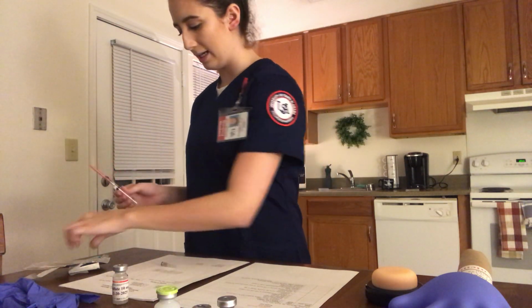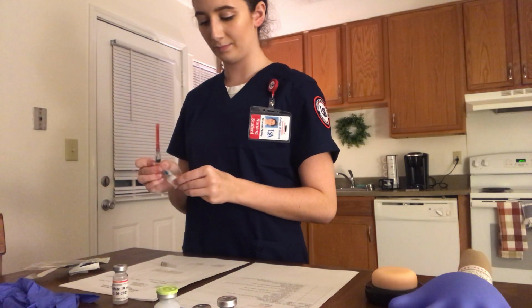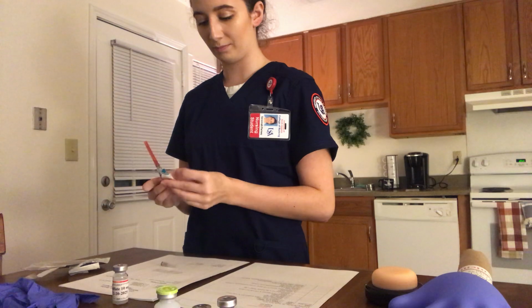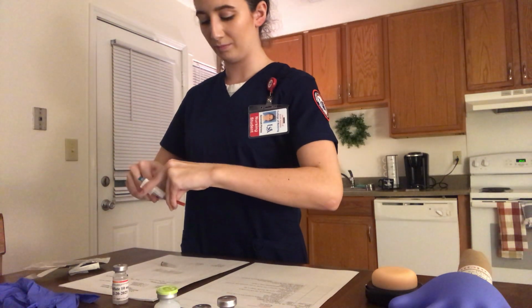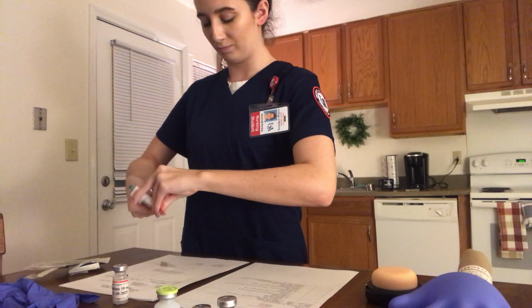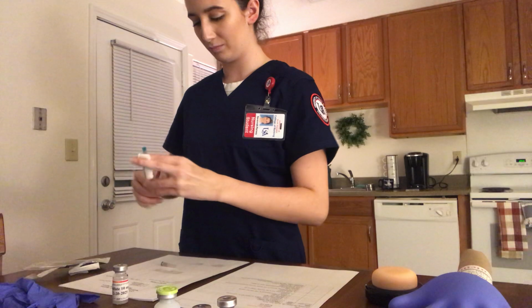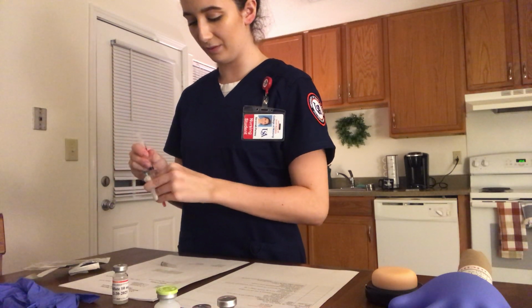After that, I will then attach the needle. Which I'm having difficulty removing.